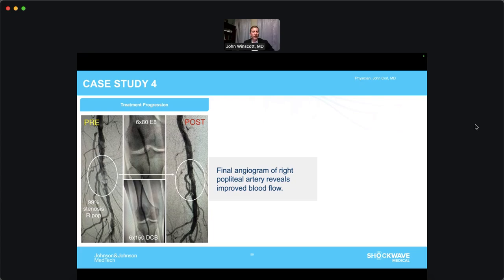And then, of course, you can have a risk of rupture of anything inside the body because of these lesions. I mean, you've got all these stalactites and stalagmites and coral reef calcium just waiting to grab things. That window is a very non-compliant material. It's difficult to rupture it. I've tried to do it outside the body, and it is very resilient. But it is possible. But actually, I personally have not had any ruptures to this point. Knock on wood. But I'm sure I'll have one tomorrow now that we've talked about it.